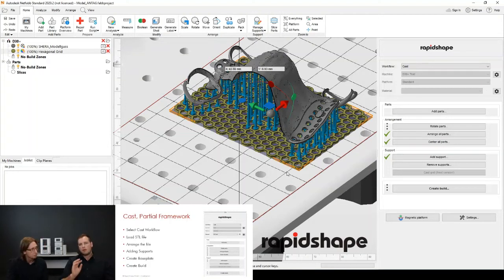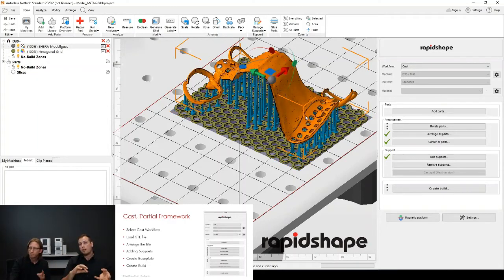Andre did mention there was a question this morning whether or not we can print cast on surgical guides. If you're printing your models, you print it on the regular platform or on the surgical guide platform. It totally comes down to your workflow at your location. So we can only recommend what we have.